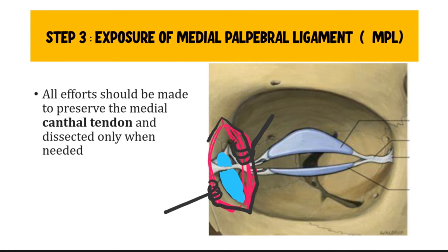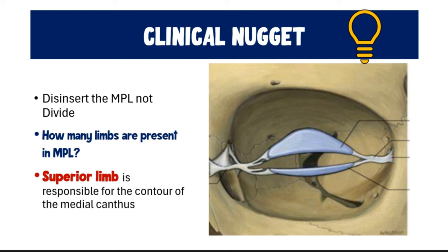As you carry out blunt dissection of the orbicularis, you will encounter a wide glistening structure attached to the anterior lacrimal crest, covering the fundus of the lacrimal sac — that is the medial palpebral ligament. Do not dissect this ligament; instead, disinsert it and reflect it back. The superior limb of the MPL is most responsible for maintaining the contour of the medial canthus. In DCR surgery, we only deal with the anterior limb, so the contour of the medial canthus is usually not affected.